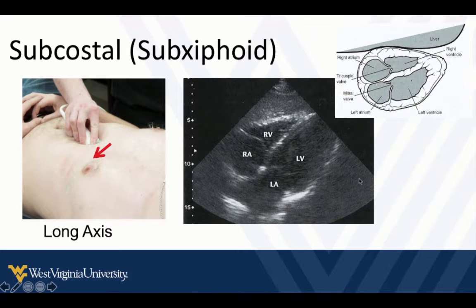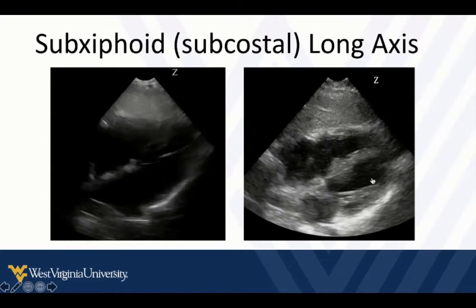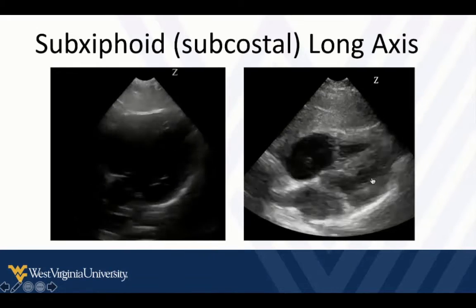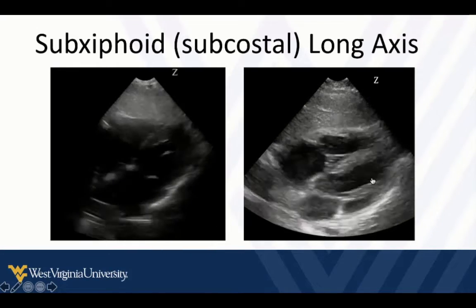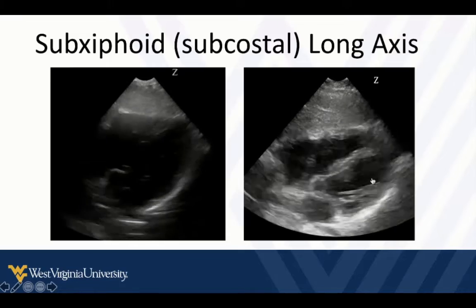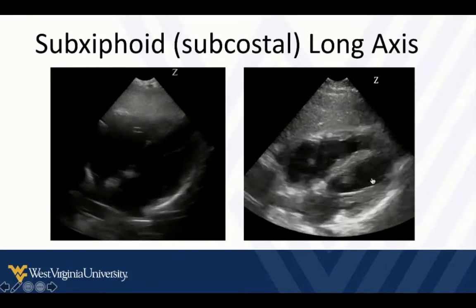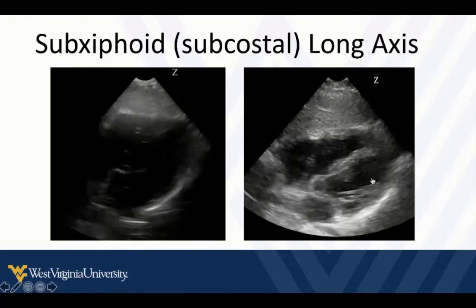Mitral valve, tricuspid valve. Here's what that might look like in real time. The heart is a three-dimensional structure, and often we can fool ourselves by making judgments from a single view. I generally recommend against making judgments from a single view because you can fool yourself if the image is not perfect or the slice is off.